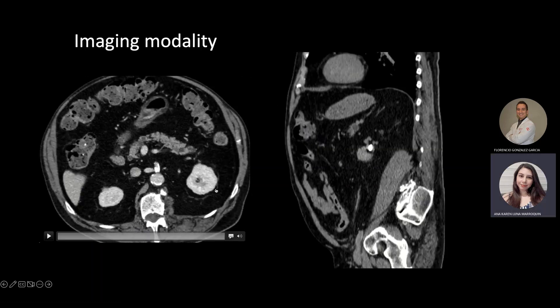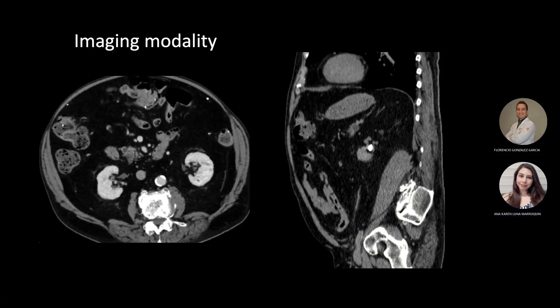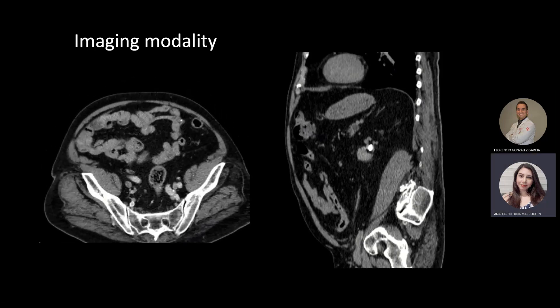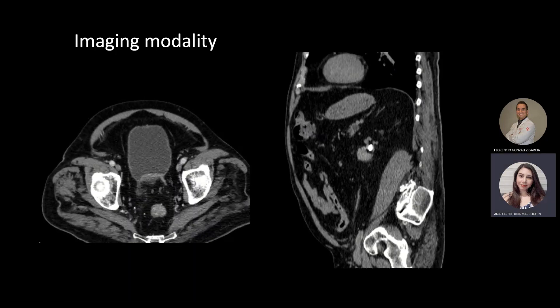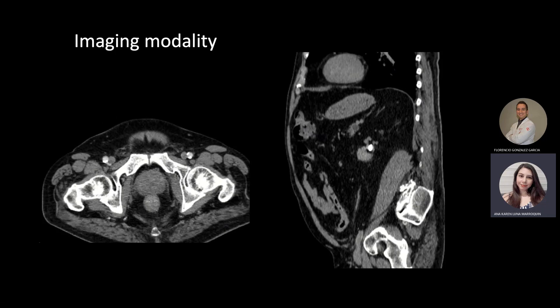The patient underwent CT of the abdomen and pelvis with intravenous contrast material. Portal venous phase images showed bilateral chronic kidney disease, atheromatous plaques and calcification of the abdominal aorta, vertebral spinal osteophytes, and most relevantly, bladder wall thickening and a right side posterolateral bladder diverticulum with a mass of soft tissue attenuation.